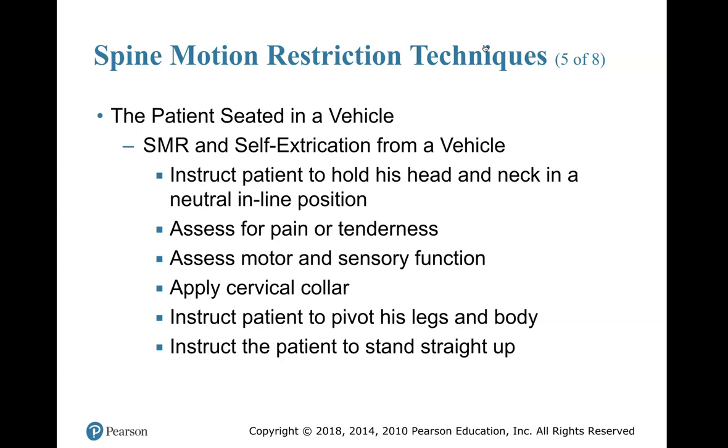Self-extrication from a vehicle. Self-extrication means the patient gets themselves out of the vehicle. Instruct the patient to hold his head and neck in a neutral inline position. That means their nose and chin are in line with their navel. Assess for pain or tenderness in their back and neck. Assess motor and sensory function. Apply a cervical collar. Instruct the patient to pivot his legs and body, and instruct the patient to stand straight up.